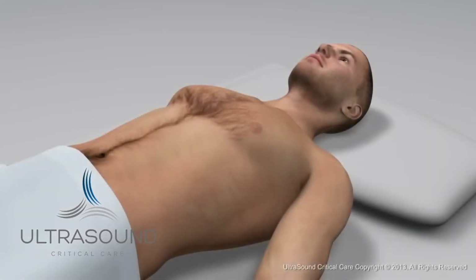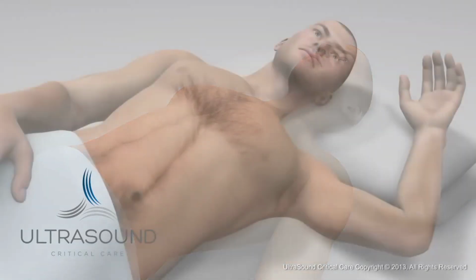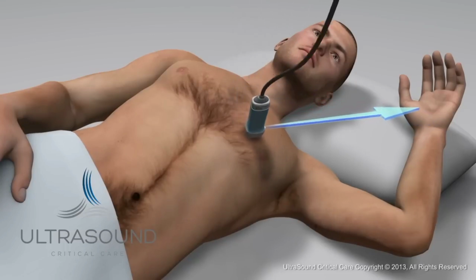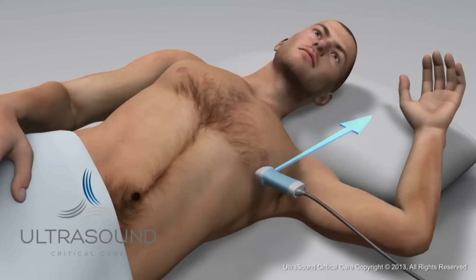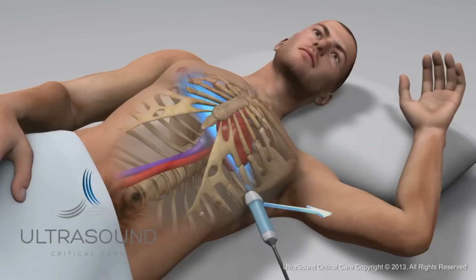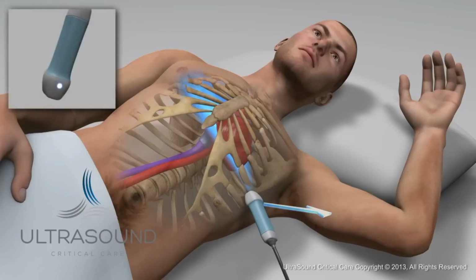Apical 4-chamber view. Turn the patient onto their left side, as this will pull the heart forward in the chest for better visualization. Scan down the nipple line with the dot aiming towards the patient's axilla. Tilt the probe upwards towards the patient's point of maximal intensity to obtain the view. You may need to tilt up and down with the probe to obtain the best image.